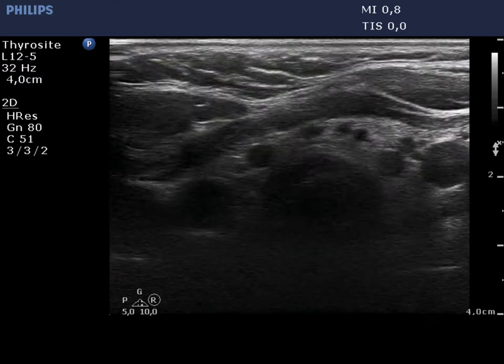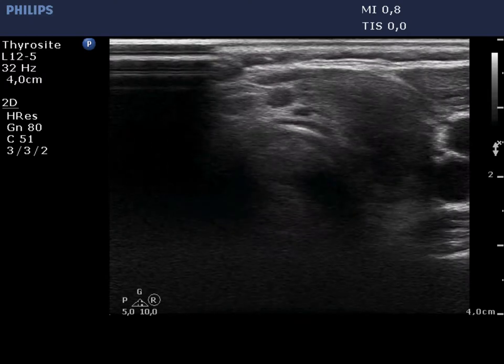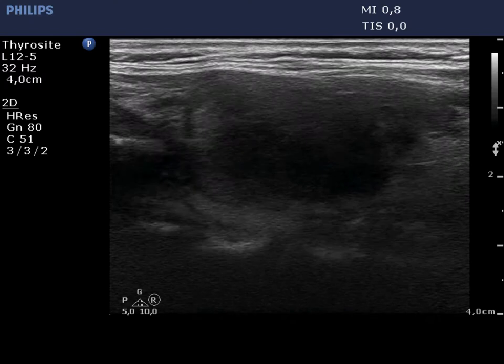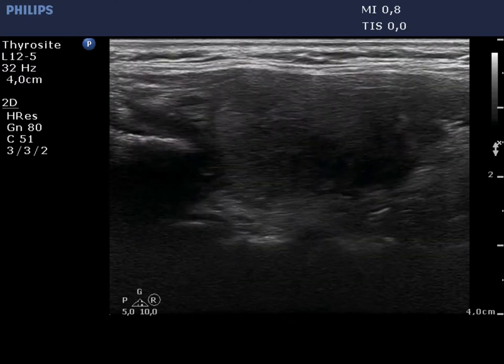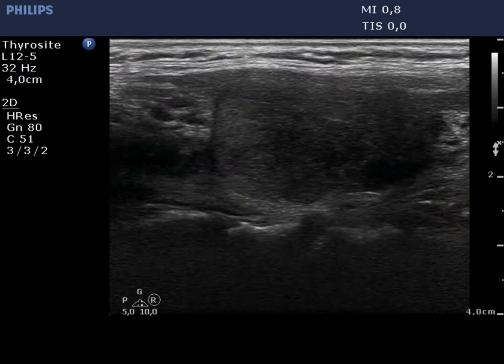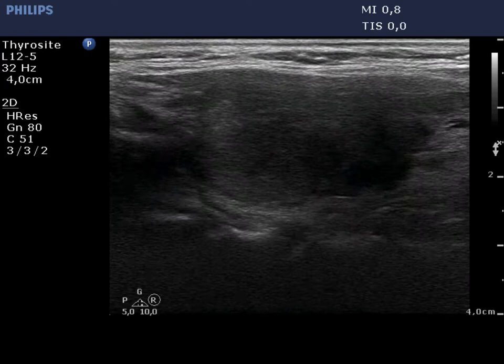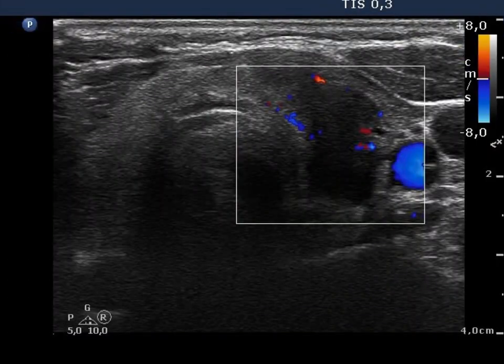The left lobe contains small, round, cystic areas and a larger confluating hypoechoic mass. No vascularization is present on the Doppler mode.